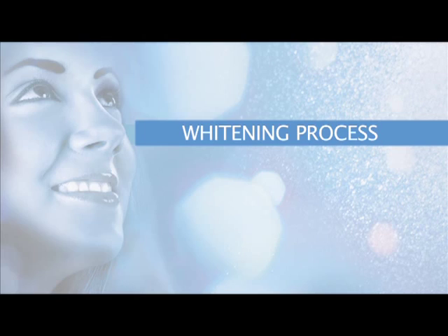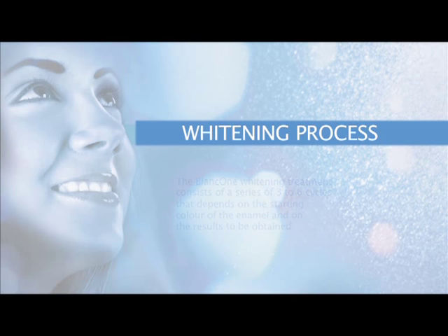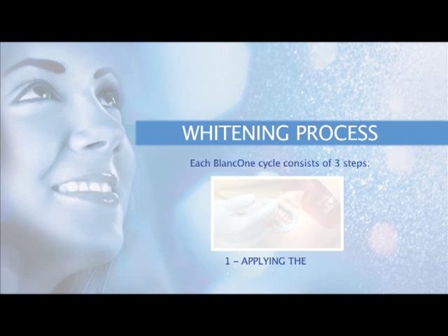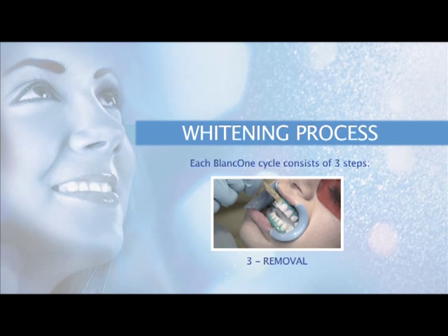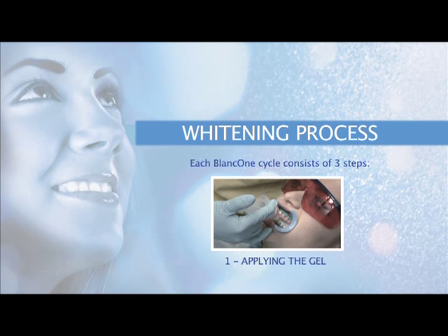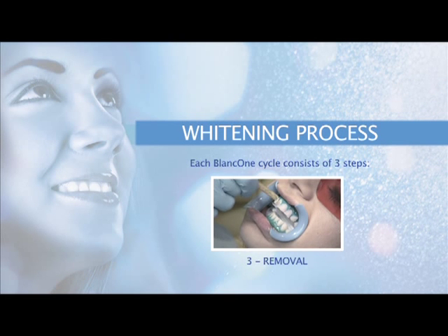The BlancOne whitening treatment consists of a series of three to six cycles, depending on the starting colour of the enamel and the results to be obtained. Each BlancOne cycle consists of three steps: one, applying the gel; two, photo activation; three, removal. Once you have become accustomed to the technique, you will be able to complete each cycle in about five minutes.